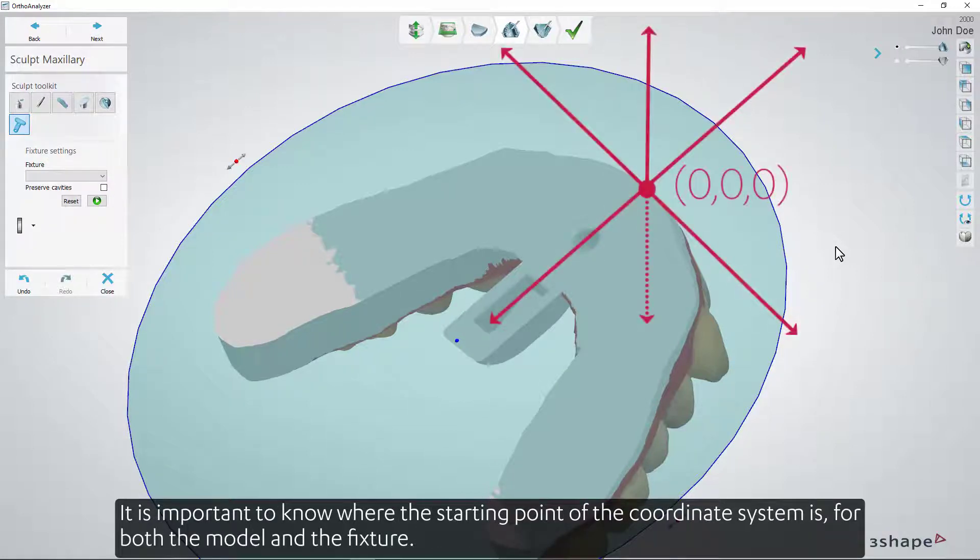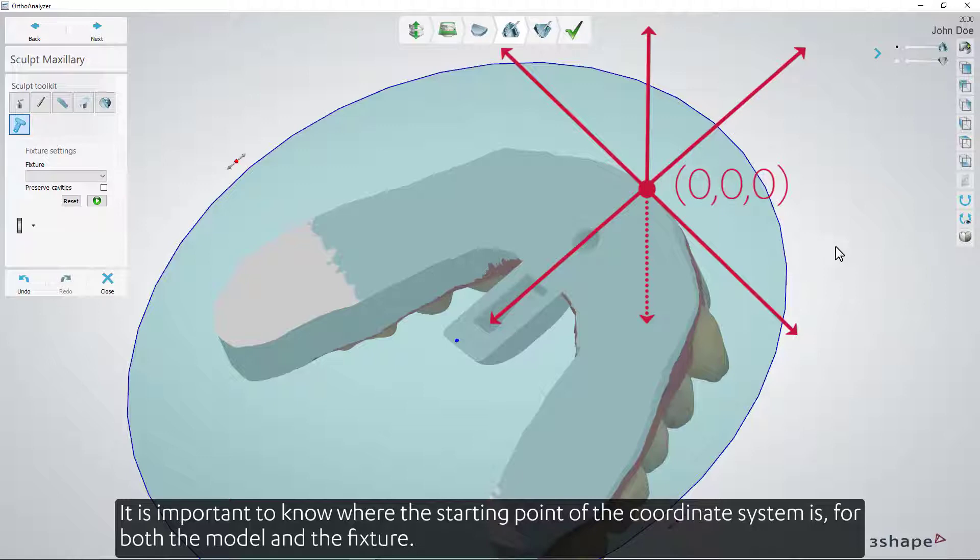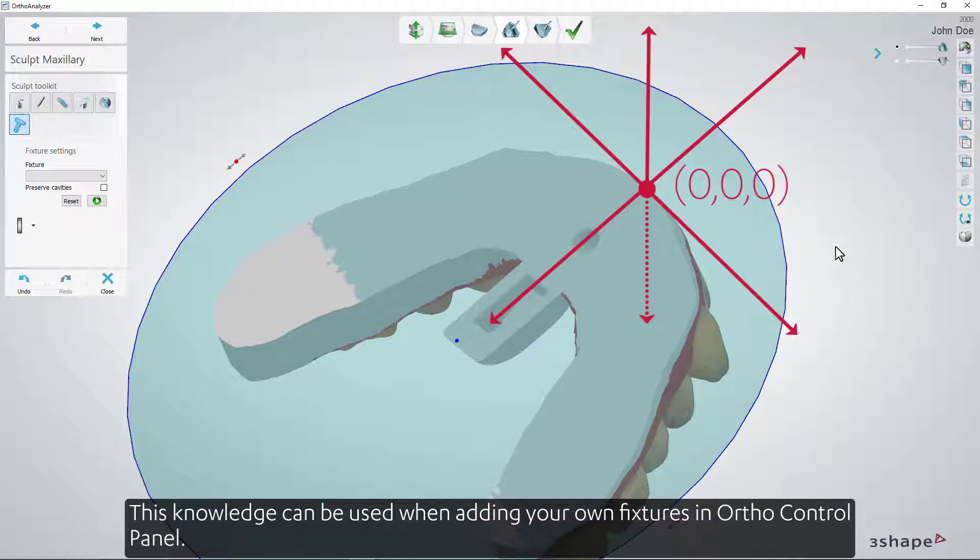It's important to know where the starting point of the coordinate system is for both the model and the fixture. This knowledge can be used when adding your own fixtures in Ortho Control Panel.